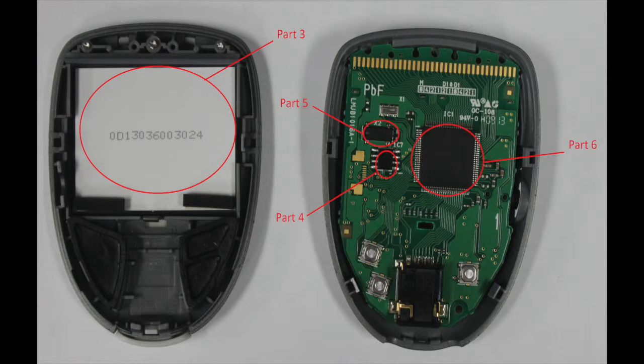This is how the circuit board communicates to the LCD screen. The parts labeled Part 5 and Part 4 are both resistors. Part 6 is the main processing center of the circuit board.